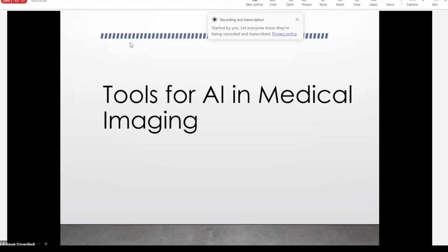If you want, you can also deal with the matrix with other programming languages or tools like MATLAB and R. But in this session, I'll be focusing on handling matrices, basically medical images, and solving image classification and clustering tasks in Python, along with some of its libraries.